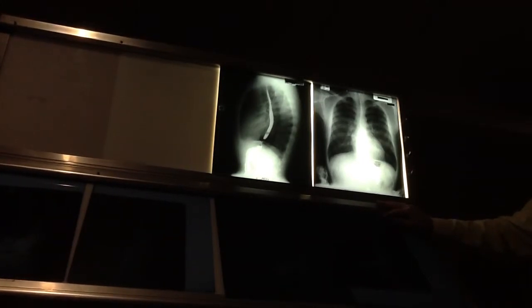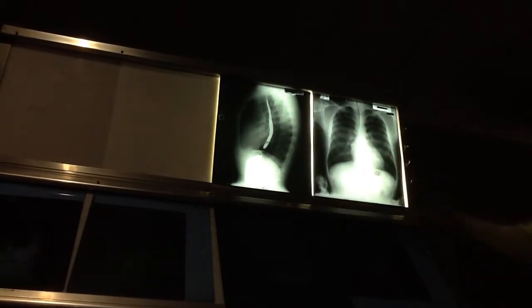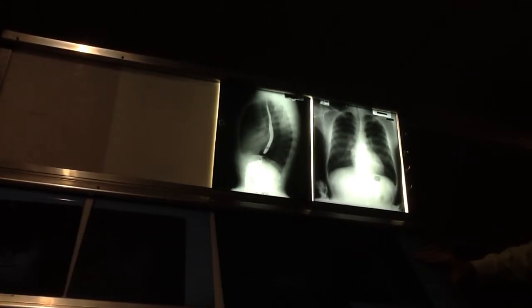Just a couple of anatomic things. One is you'll notice that we can see the rugal folds, I call them rugal. You can see the muscular folds well here. The proximal third of the esophagus we have control of. Okay, so we can swallow, and that proximal third, we're initiating the peristalsis.